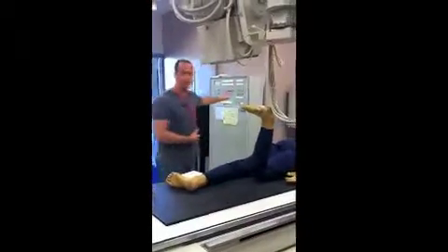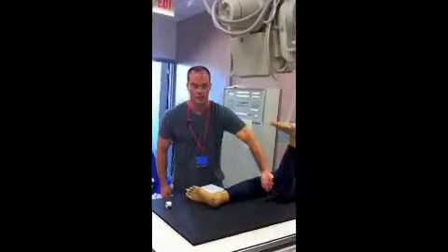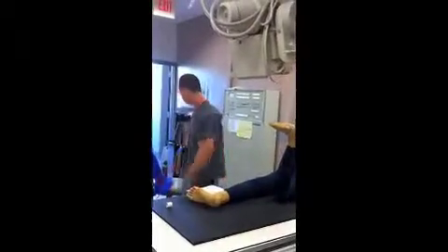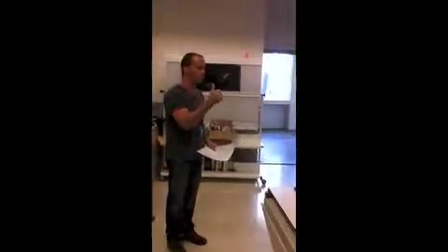I've set my technique to 60 at 32 because we're shooting for the patella, not the rest of the knee. Again, going to shield the patient as much as possible. And time to take the exposure. Don't move. Boom. Okay, cut.